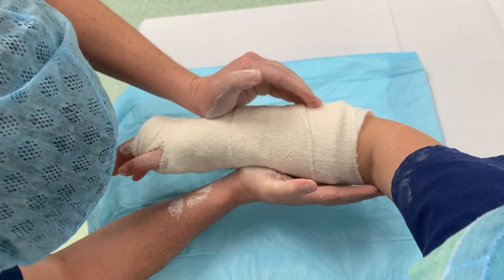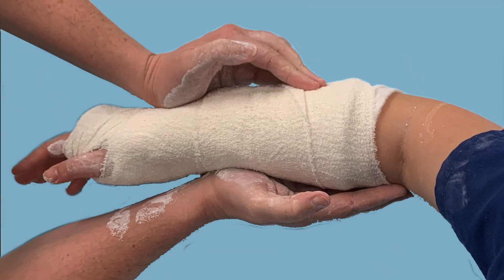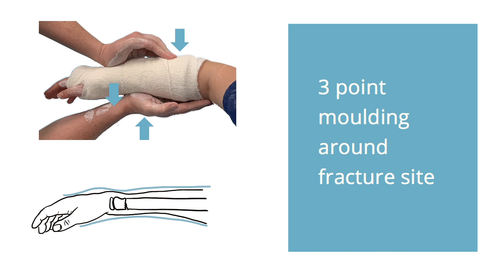Now we can mould the plaster further with slight ulnar deviation and apply three-point moulding. The first point of moulding is on the dorsal side proximal to the wrist crease and distal to the fracture. The second point is on the dorsal side proximal to the fracture. The third point of moulding is on the volar side as the apex, providing a counterforce.